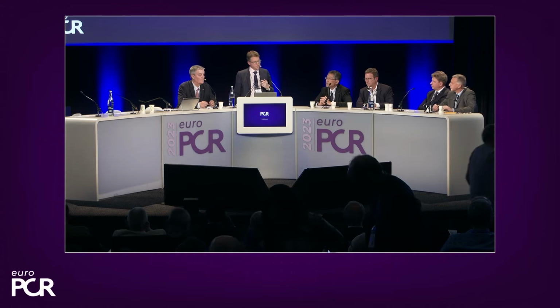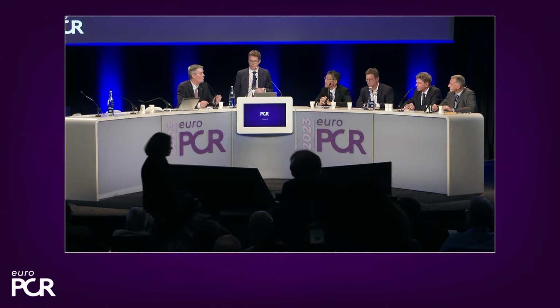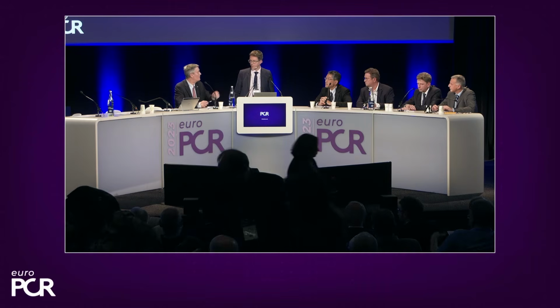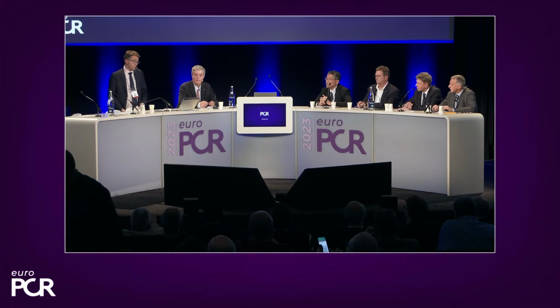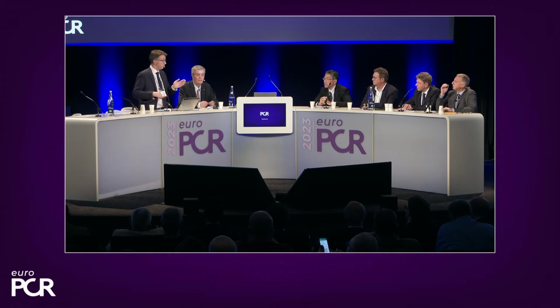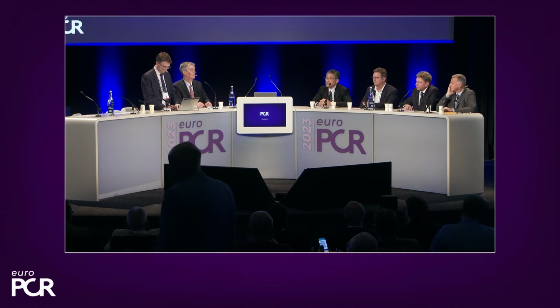So we've had lots of procedural questions, and while we're waiting for Yoshi to come, we can answer some of those. There was a question around drug-coated balloon, both side branch and main vessel. Should we be considering that? I don't know whether you have an opinion. I do. I think we didn't touch the side branch, the diagonal, so there's no risk of restenosis there.